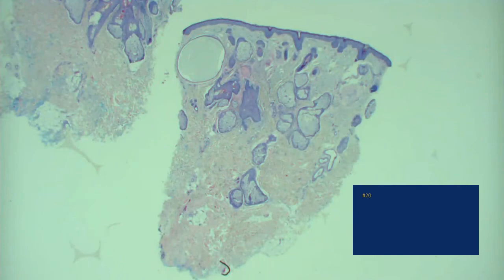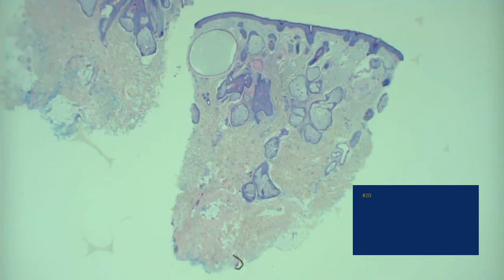This is not acral skin. Yeah, what part of the body is it from? Looks like probably face. Yeah, face. A lot of large sebaceous lobules without a lot of terminal hair follicles down in the fat, so this is really perfect for the face.